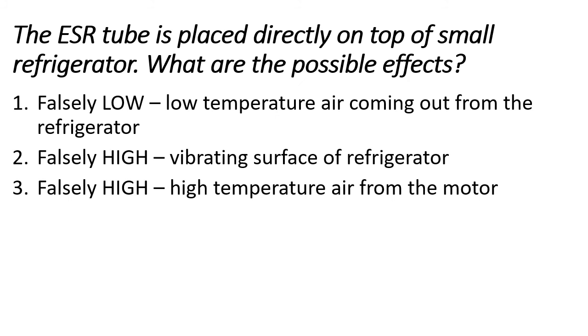Okay, next. Situation naman tayo or application. So, madalas to tanungin sa board exam schools, I mean yung mga review centers, no? So, ito yung tamang answer for this situation. So, bibigyan tayo ng ganitong case. The ESR tube is placed directly on top of a small refrigerator. What are the possible effects? So, tatlo ang pwedeng explanation. Falsely low, if ever malapit ang ESR tube dun sa pintuan ng refrigerator, which can release low temperature of air. So, low temperature, low ESR.